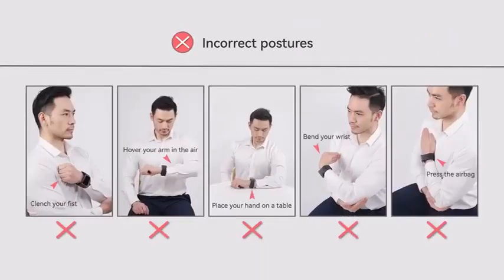Keep your body relaxed and do not press the airbag. Do not clench your fist, hold your arm in the air, place your hand on a table, bend your wrist, or press the airbag on your watch.